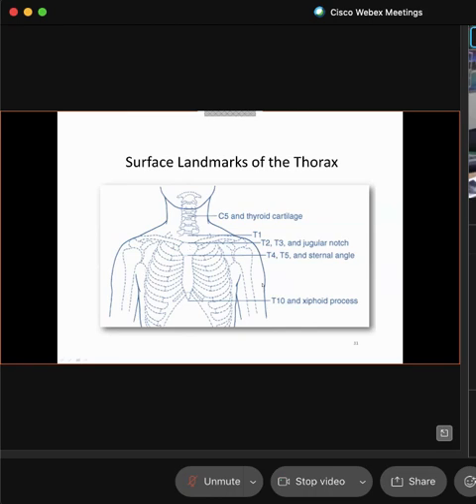Everything that we're going to do, if we want one side and the other side, we're likely going to place it at the mid-sagittal plane. That's the vertical axis. But the horizontal axis defines what our objective is. Now, I'll ask this: where do we place our horizontal axis if we want to image the entire thorax?